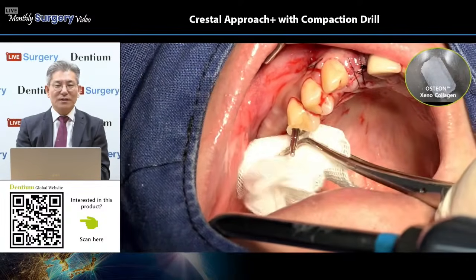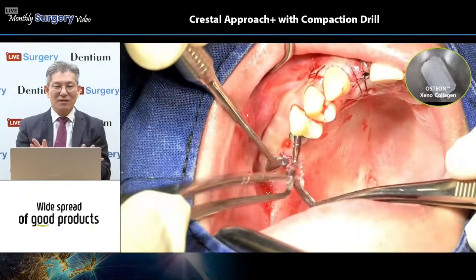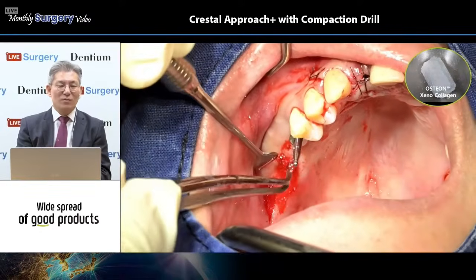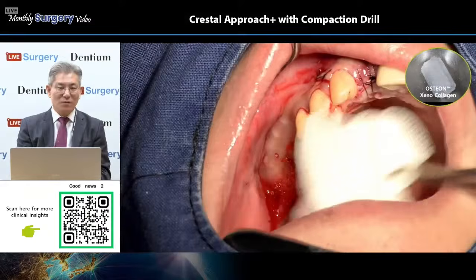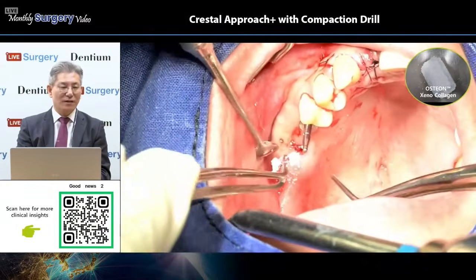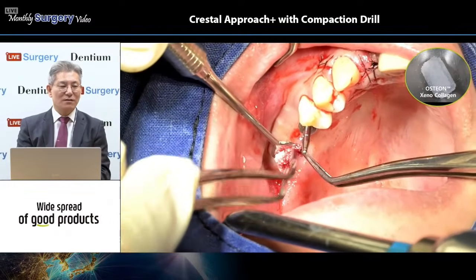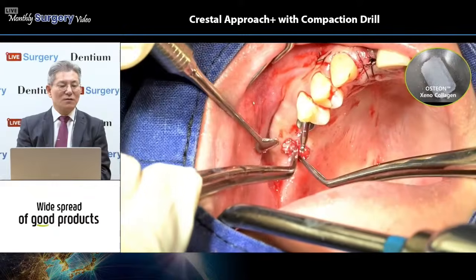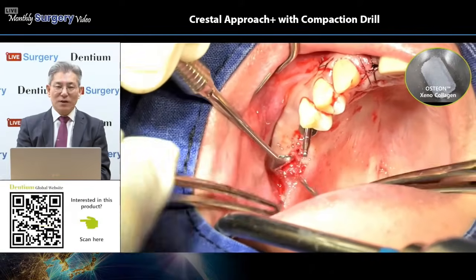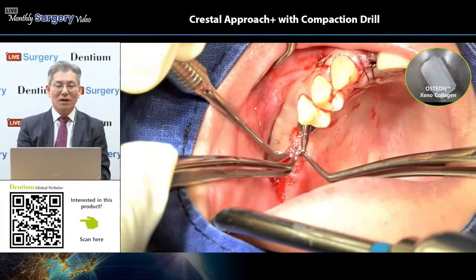The first one, particulated bone sometimes scatters and is difficult to handle. However, the collagenated bone graft material like osteogenocollagen is easy to handle, easy to mold, and not too much scattered. So this one is efficient for sinus elevation or GBR procedure and minor bone grafting procedure.